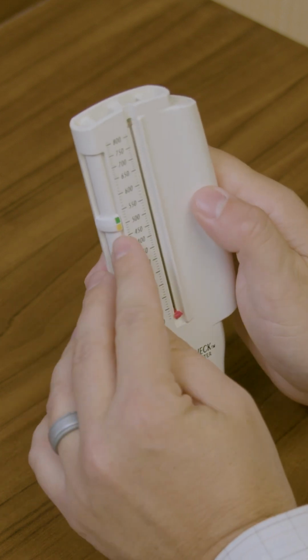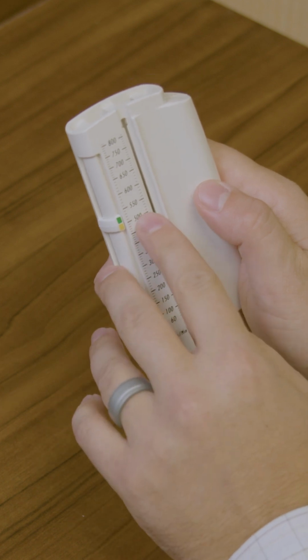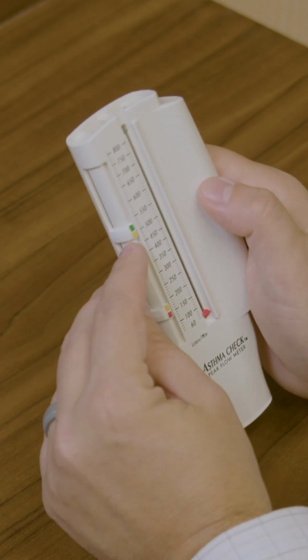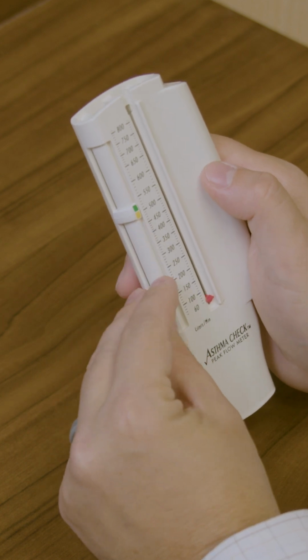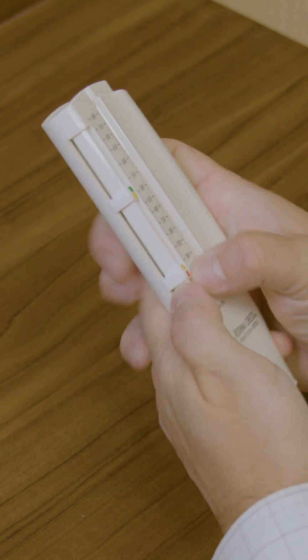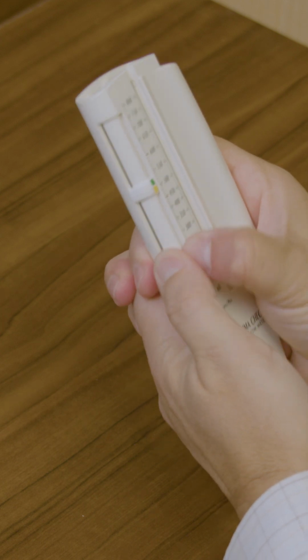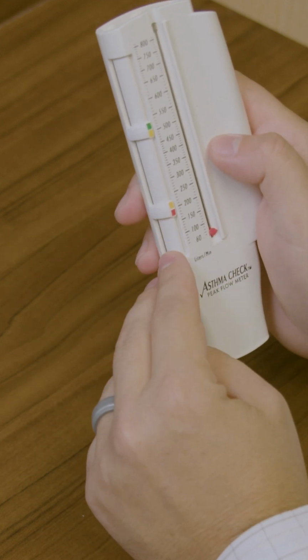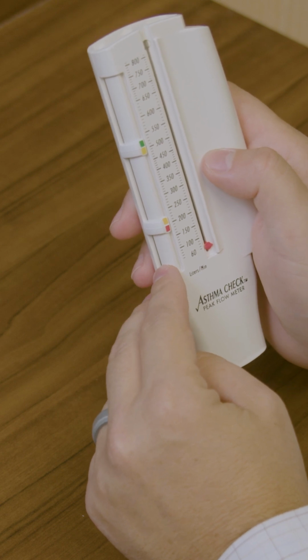Once you know what your true zones are, it's important to move them into the appropriate location. And so you can see on this meter, anything above 500 liters per minute would be considered in the green zone. Anything between 500 and 200 would be considered in the yellow zone. Anything below 200 would be considered in the red zone.